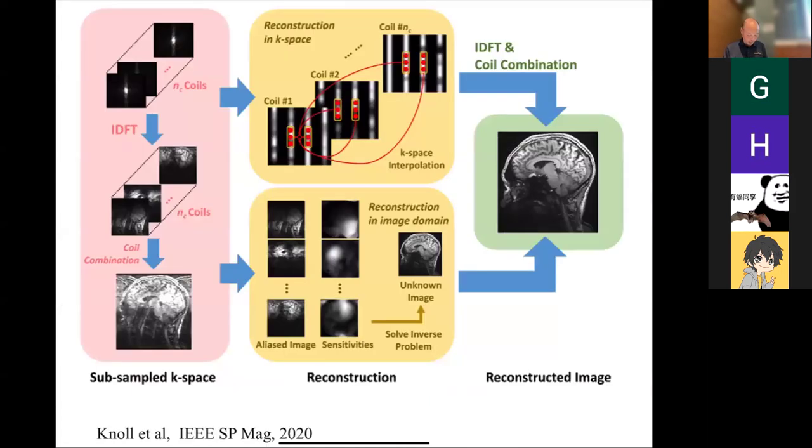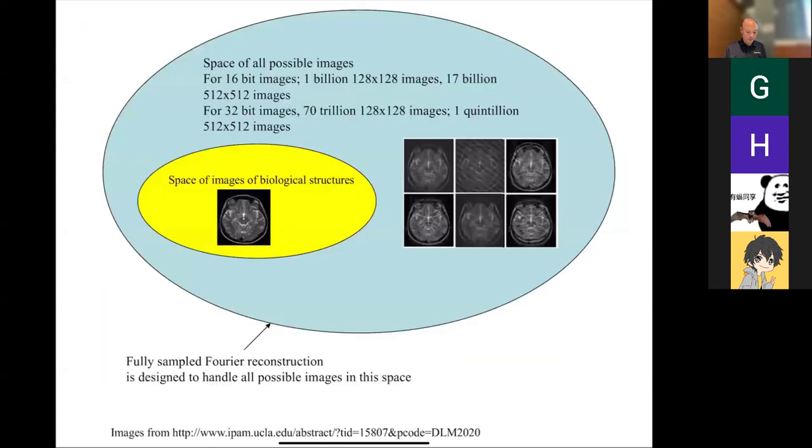Okay. This is a nice article in IEEE Signal Processing Magazine that goes over these, but essentially what we've covered is either SENSE recon here, or GRAPPA. Those are the two main approaches to parallel imaging, and everything up to that point has been a variation on that.